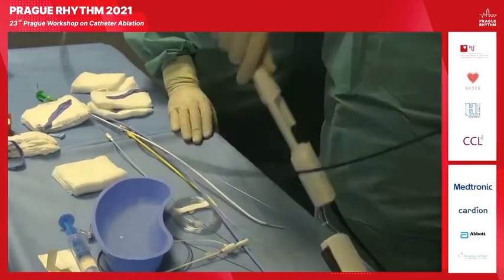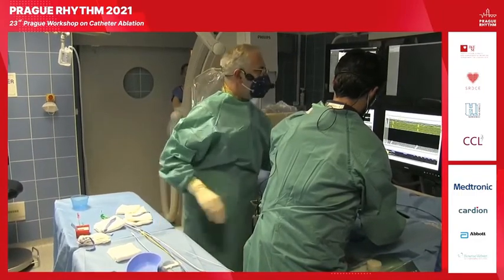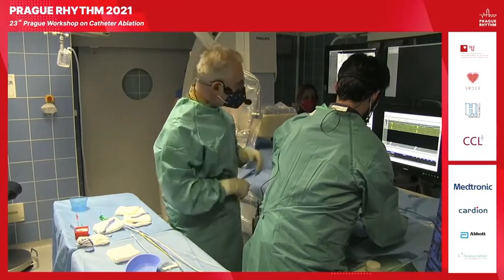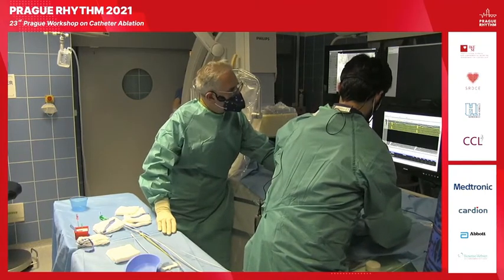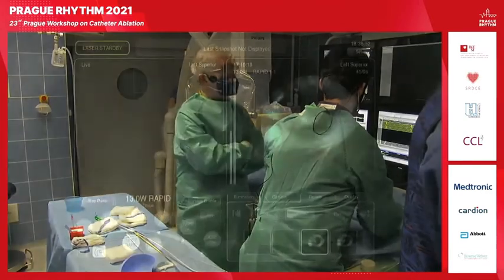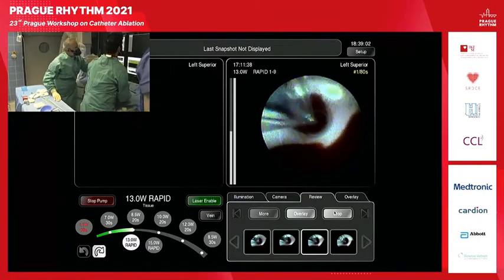So for all patients, what we are using right now, we have all patients with an esophageal temperature probe on site. So what we did on this guy, with regular distribution of 4 veins, we did 2 lefts and the right inferior one. And we will show you from the playback, so please focus on the laser console screen. If you can show, Matěj, the left superior vein. It will be a little bit shorter than usual, but it is continuous, automated, rapid mode rotation.